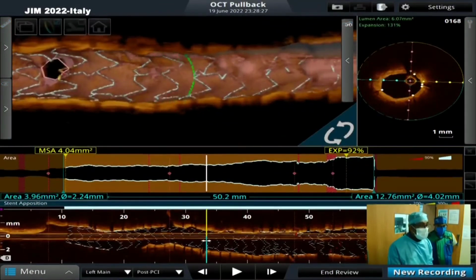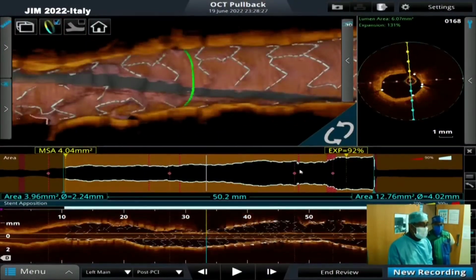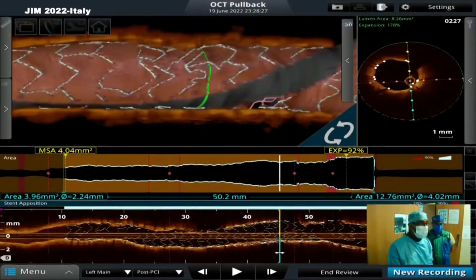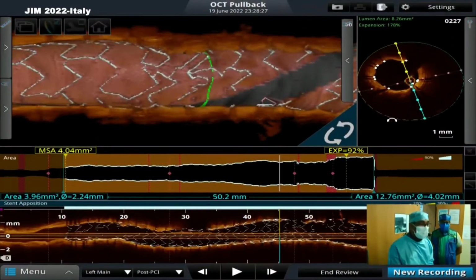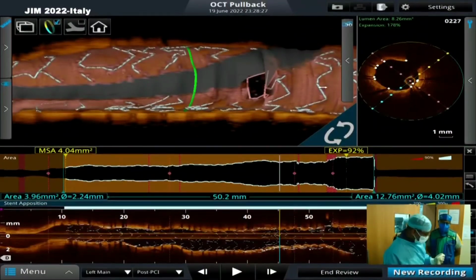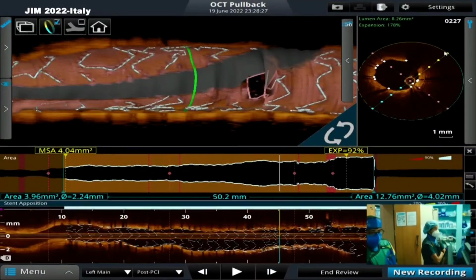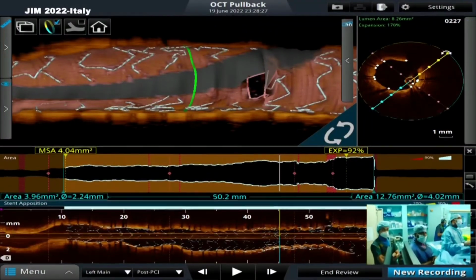Then as we come more proximally, precision, that's what I call it. The position of the struts is unpredictable, however. It's a tremendous precision, and that is again at another diagonal. So the diagonal ostium looks really good. Great. Would you want to do something more?